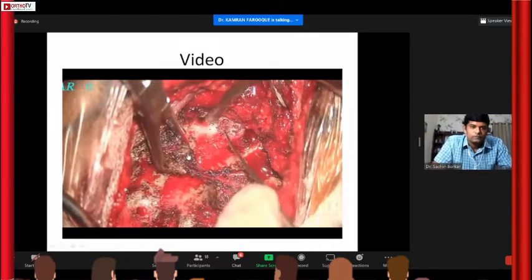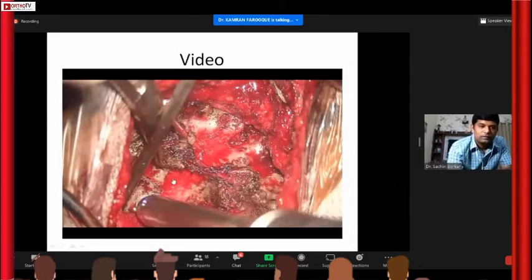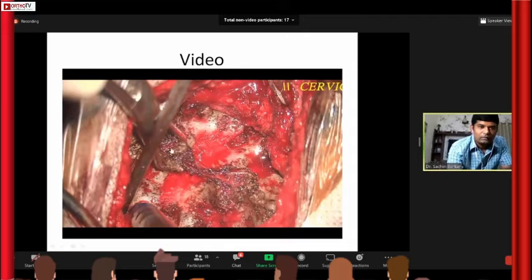Once again, just orient, because people may not know which is cranial, which is caudal, medial, lateral. Stop and orient once again. Yeah, basically this is the cranial and the caudal, and obviously this is the midline, this is the lateral position.